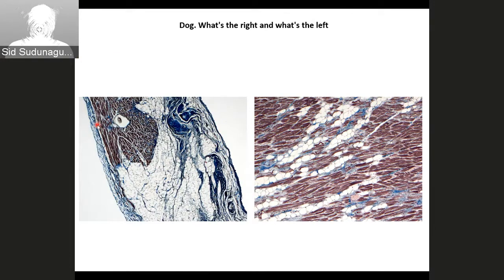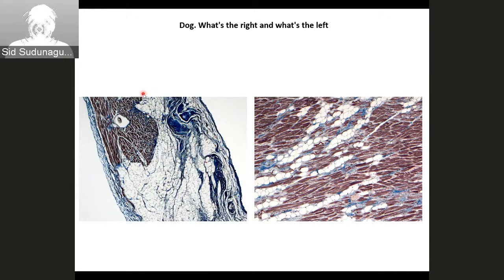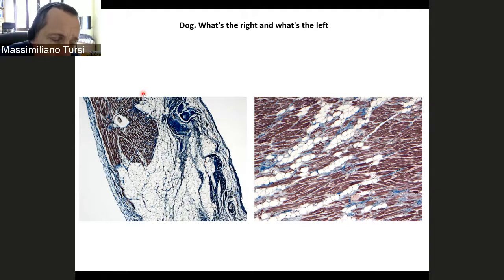I mean, can you also have the same processes affecting the left ventricle? Why not? I have to say, this kind of finding is also possible in the left ventricle, and also in the atrium. It's not very common, but there are some papers that describe arrhythmogenic cardiomyopathy with fibrofatty infiltration in the atrium. But we spoke yesterday about the dog, not usually the right but the left ventricle, a kind of histological phenotype in case of?